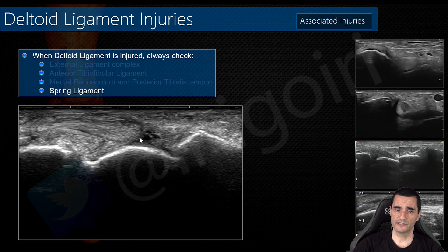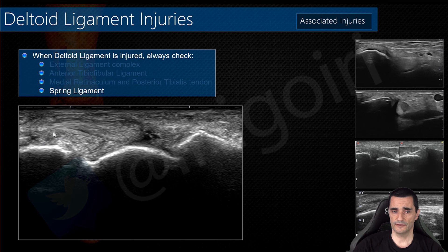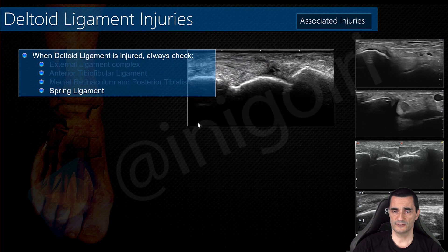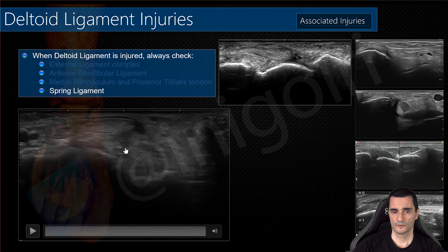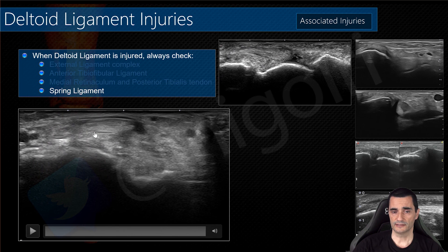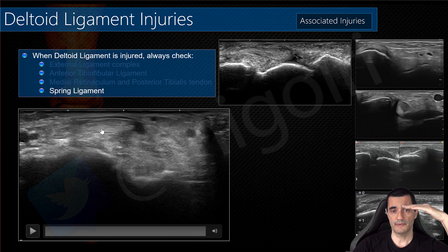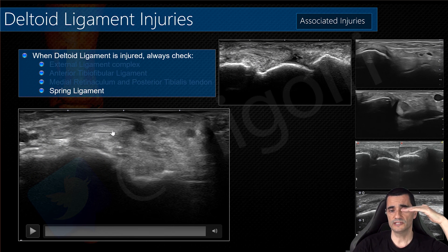We always check this tendon — we follow the posterior tibialis until it travels between these three bones: the sustentaculum tali, the head of the talus, and the navicular. In the video, we start by locating the posterior tibialis, place the probe in the same axis as the sole of the foot, and follow it distally.